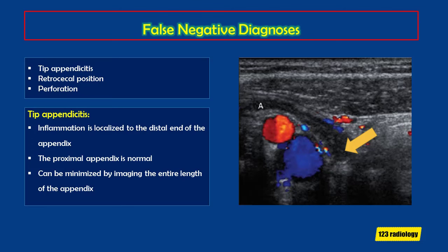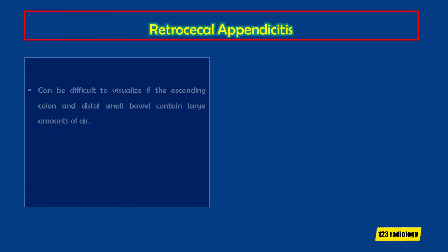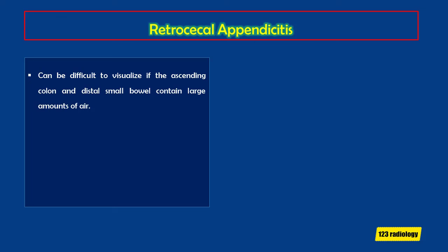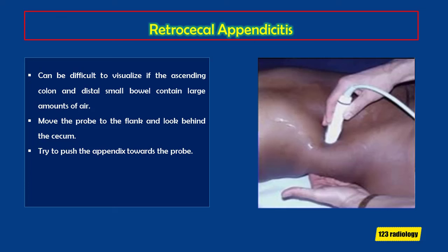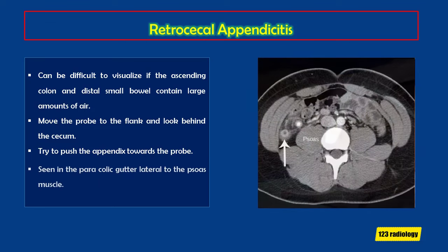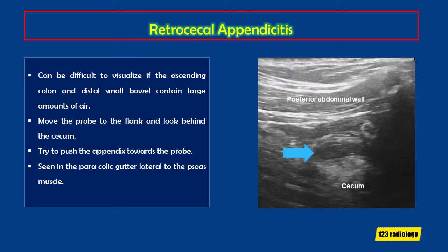A retrocecal appendix can be difficult to visualize, particularly if the ascending colon and distal small bowel contain large amounts of air that cannot be easily compressed. In retrocecal appendicitis, move the probe to the flank and look behind the cecum, or push the appendix towards the probe by placing the other hand in the flank and pushing anteriorly. The majority of appendices are intraperitoneal medial to the psoas muscle, but some will be retrocecal, seen in the paracolic gutter lateral to the psoas. In this case, the appendix is well visualized by posterior approach through the flank, seen enlarged with increased echogenicity of surrounding fat.